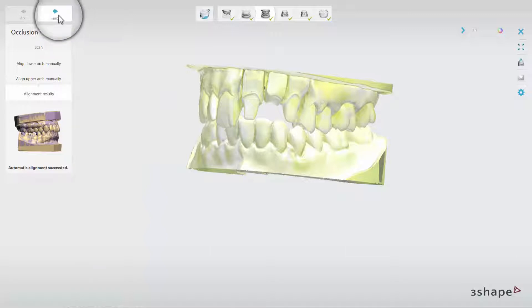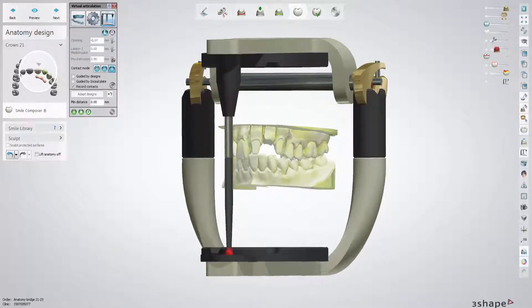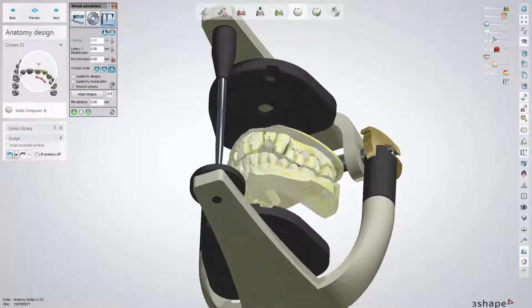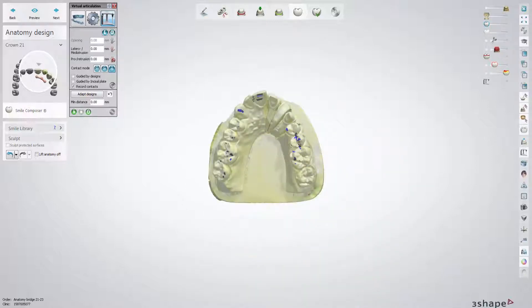Now you can start designing restorations using Dental Designer. Use of the Dynamic Virtual Articulator allows you to design restorations taking into account not only the static but the dynamic occlusion too.